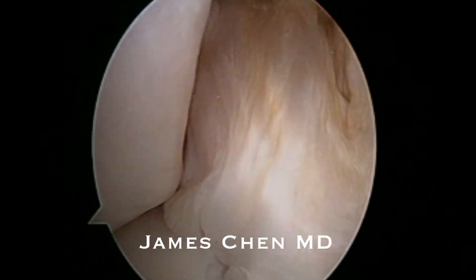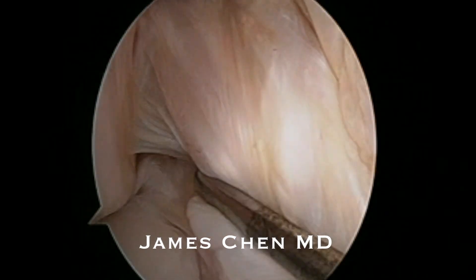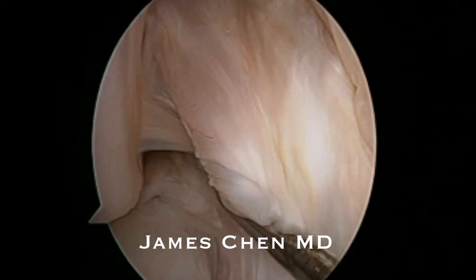I then probe the ACL and it is intact; however, it is vertical up and down, allowing for rotation and the knee to pivot.